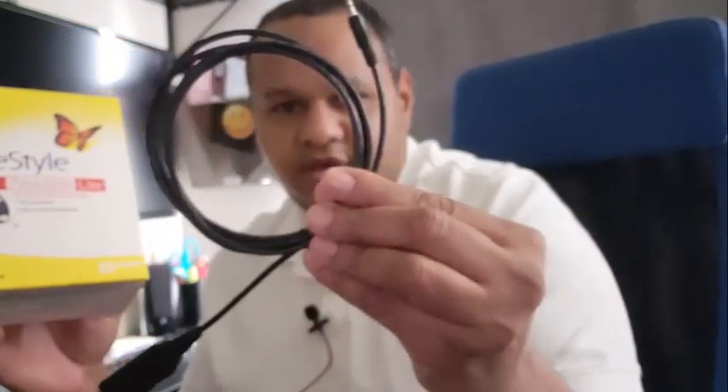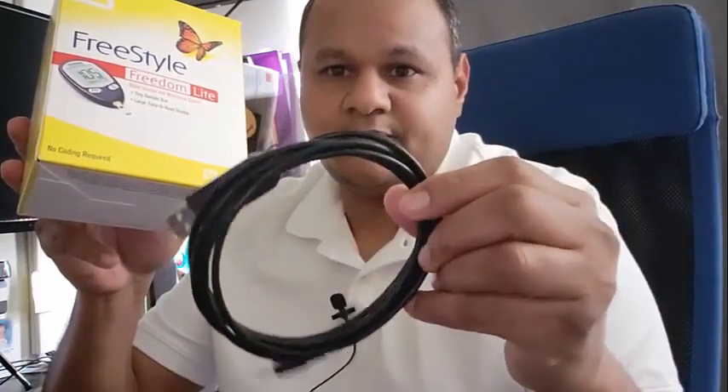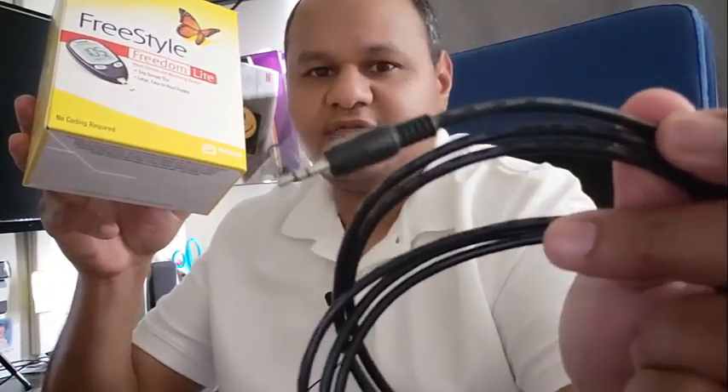Hello everyone, this is Jose from Freestyle USB Cable. I wanted to do this quick tutorial and instructional video on how to use the Freestyle Freedom Light meter with the Freestyle USB cable. This is the USB port and this is the 3.5mm audio jack connector.